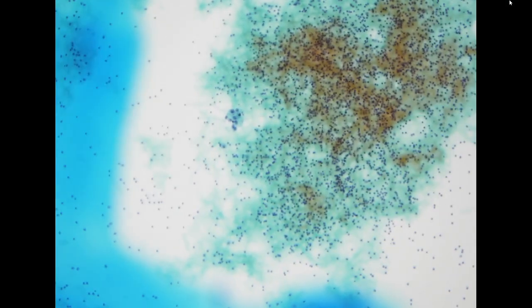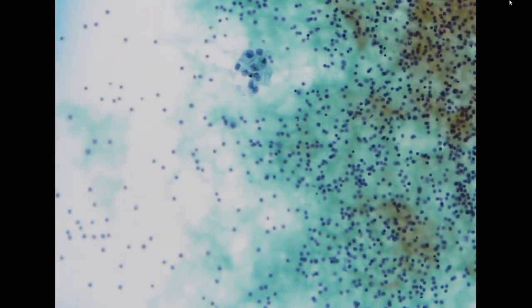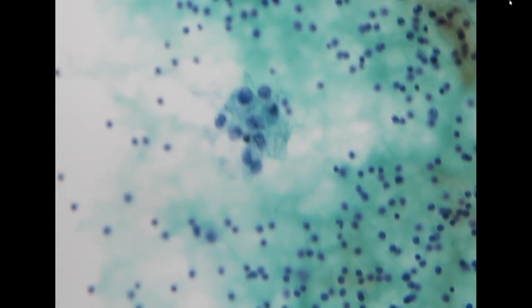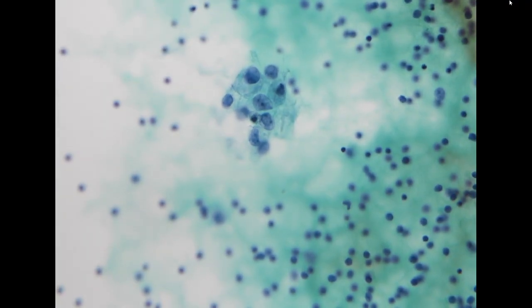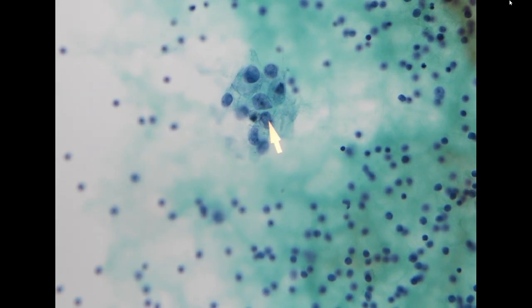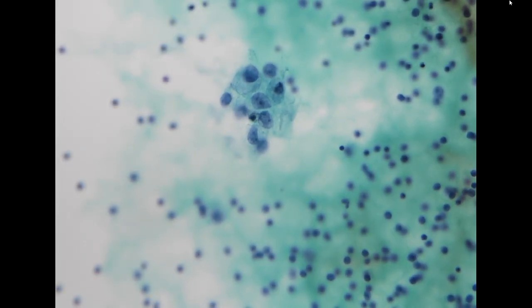So the patient has a prior history of lung adenocarcinoma. We have a few clusters of three-dimensional cells. The nuclei are enlarged. You see some variation in size and shape, and some nucleoli as well. The cytoplasm is foamy. So this is compatible with metastatic adenocarcinoma.